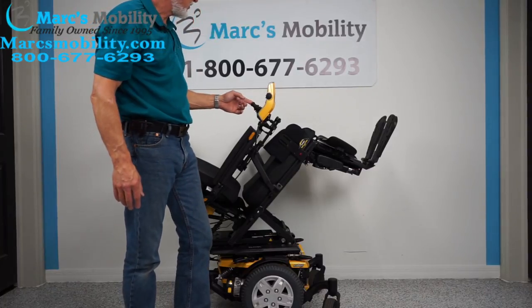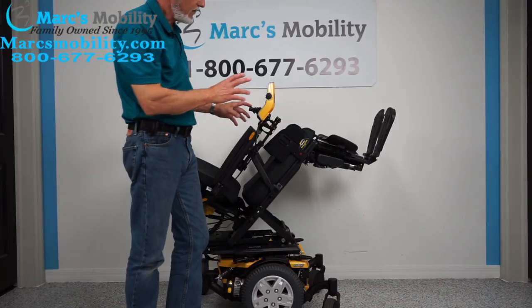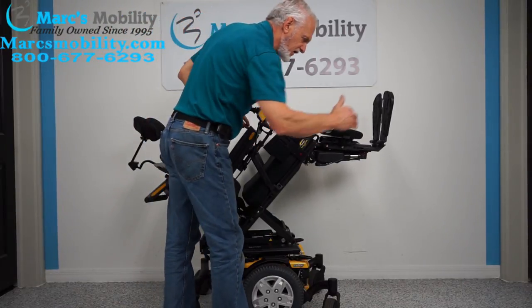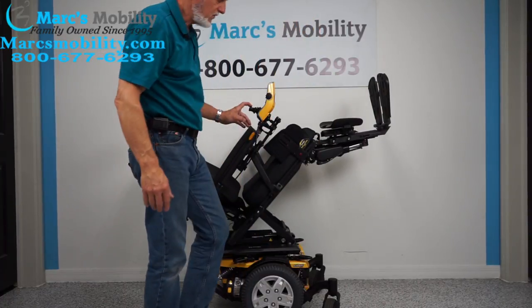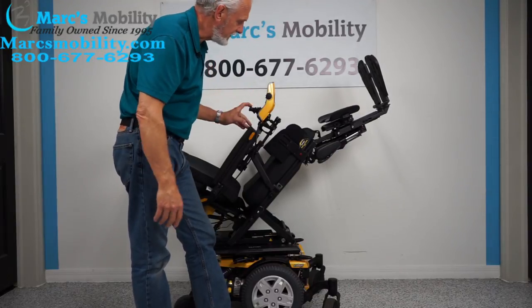The next feature is the electric feet. These feet are electric, so we can adjust them. If you're 5 feet tall or 6 foot 2, we can set these to whatever size — this whole chair can be customized for your height and weight.